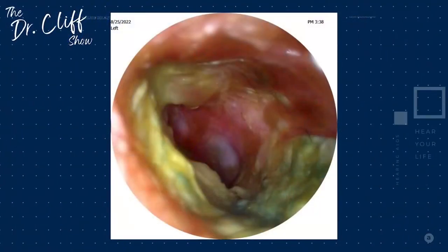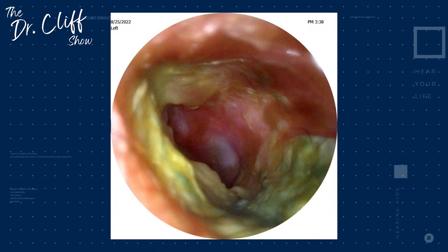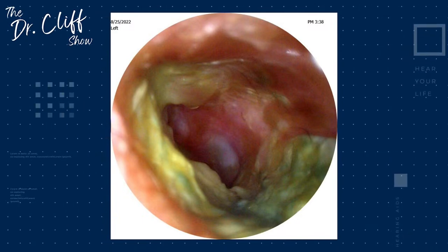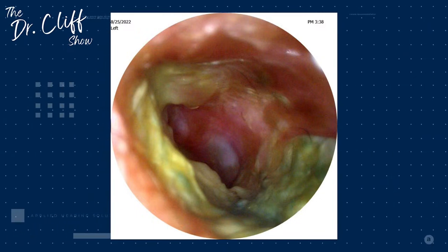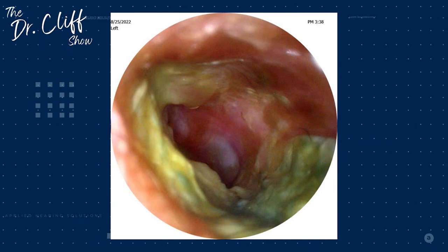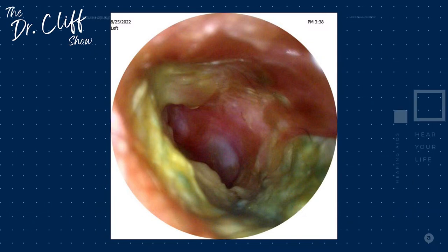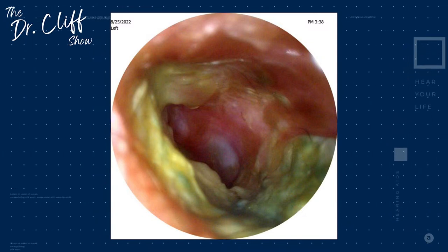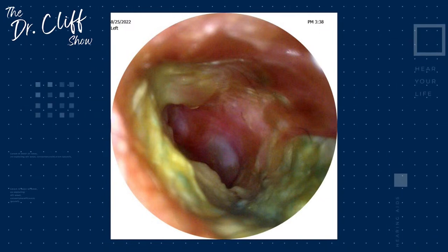And this patient in particular had a pretty gnarly infection. I think we've got a picture of it coming up here in a moment. Yeah, oh yeah, there we go. Okay, so patient comes in and he says, listen, my ear canal is itching like crazy. I am this close to just scratching it with tweezers and a pencil. I need you to look in there for me. He also said on top of that, I can't really hear that well out of that ear, and it's driving me nuts. Obviously, we both took a look in the ear canal together, and this is what we saw.